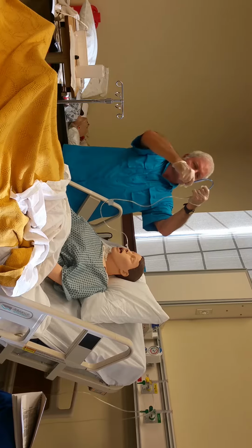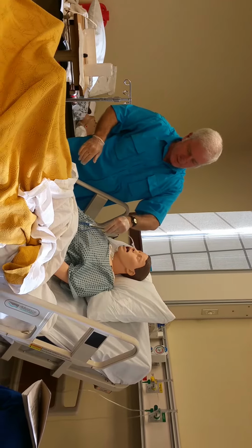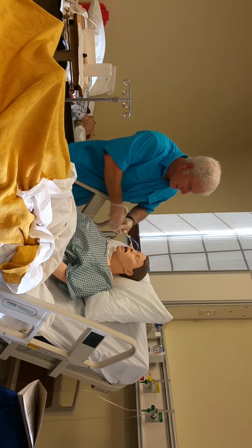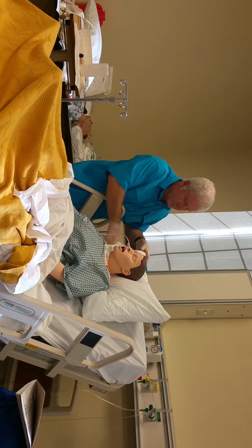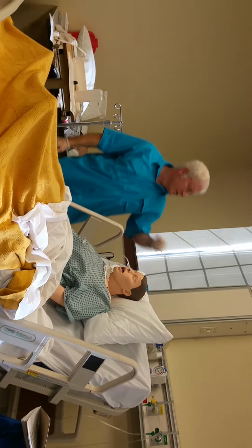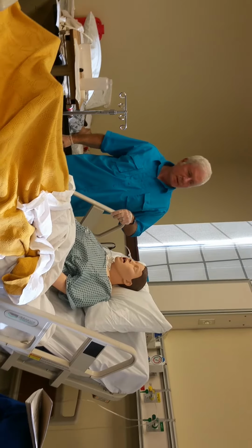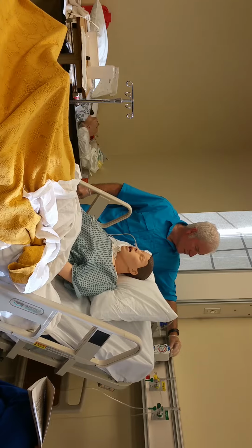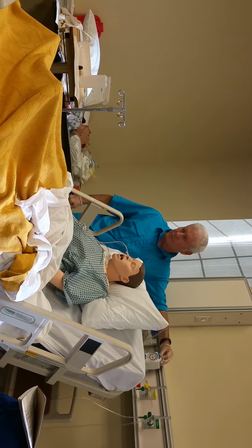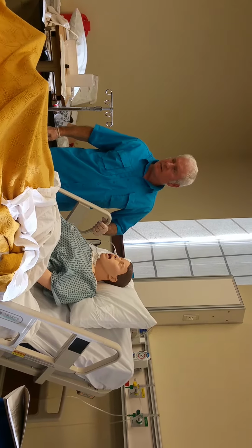Take this off, clamp it, and you can stick it in his pocket. If he doesn't have a pocket, you can just stick it behind his pillow or something, okay? And then you can turn the suction back on. Don't forget, I had it on regular suction, but the order was for low intermittent, so don't forget to switch it over. I didn't do that. Okay, any questions about the NG tube?